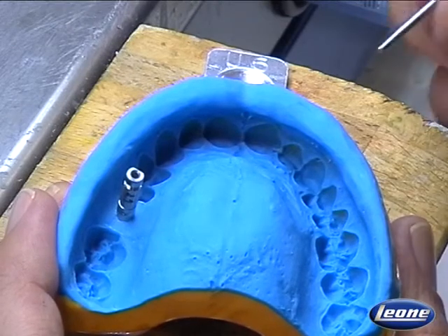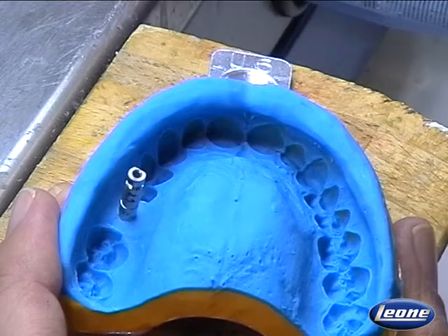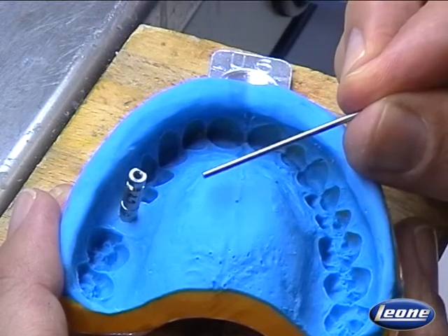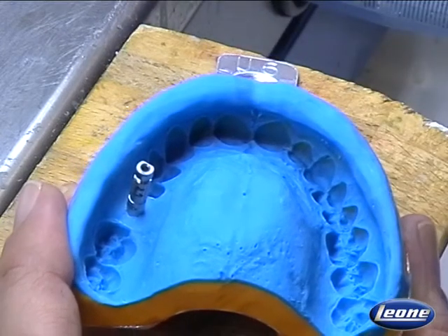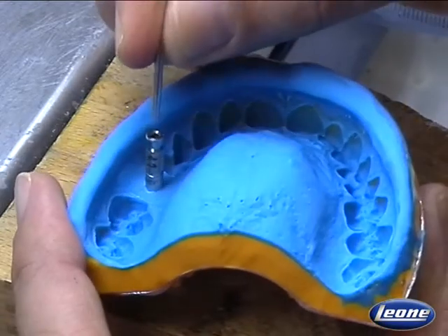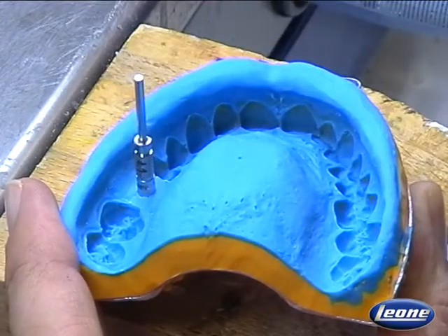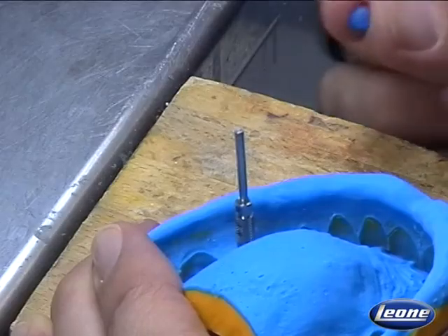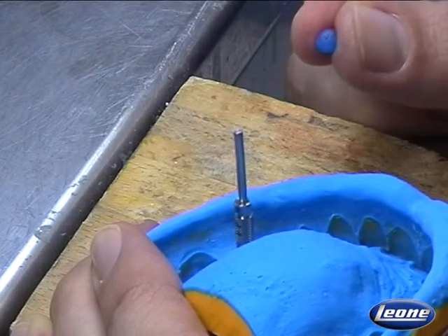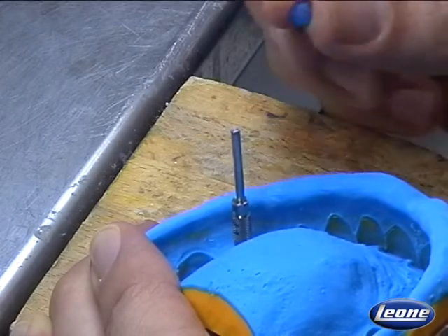In the analog's packaging, there is a short pin and a long bar. The short pin is firmly placed onto the analog thanks to its conical interface. Then we place a small ball of wax on the top of the pin.